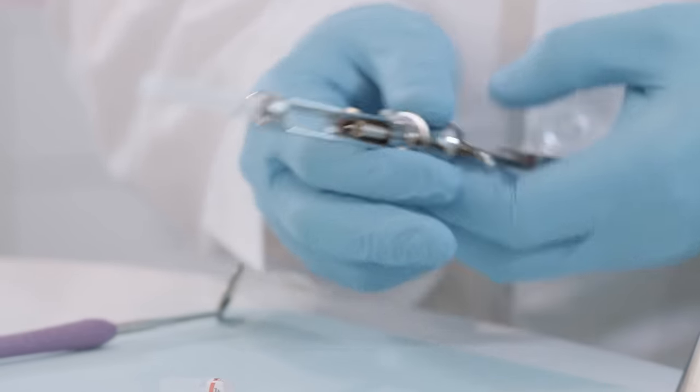An important advantage of this vertical approach is that the overhang of the infraorbital rim protects the eye from accidental needle puncture. Correct orientation of the needle bevel during insertion offers two potential advantages: first, if bone is contacted prematurely, the heel of the needle bevel will tend to glide gently off the bone without scraping the periosteum; second, the spread of anesthetic into the foramen and canal may be aided.